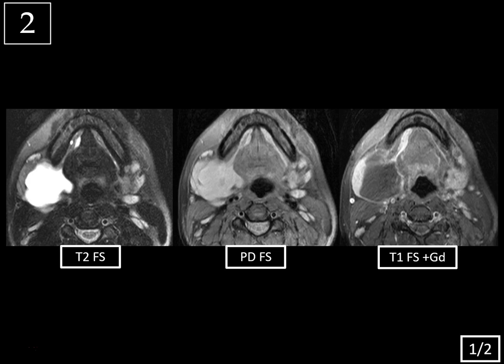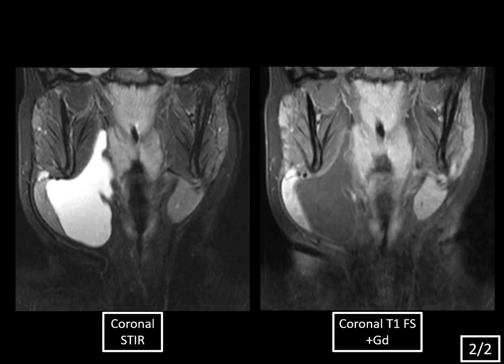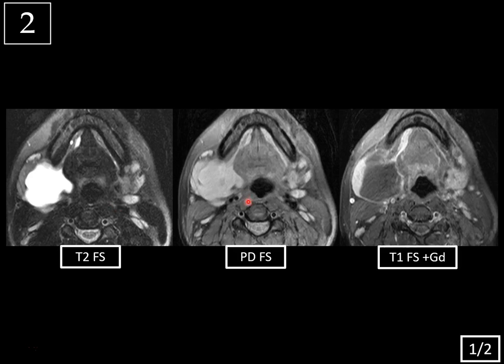All right, case two, slide one of two, MRI of the floor of the mouth. We have axial fat-suppressed T2 proton density and T1 post-gadolinium images of the floor of the mouth. Notice how there's this lobulated T2 hyperintense, T1 hypointense cystic mass posterior to the right aspect of the mandible and anterior to the sternocleidomastoid muscle. So you might initially think, is this a second branchial cleft cyst, given the location? Or could it be a cystic or necrotic lymph node? Well, let's review the floor of the mouth anatomy because it can be a bit confusing.